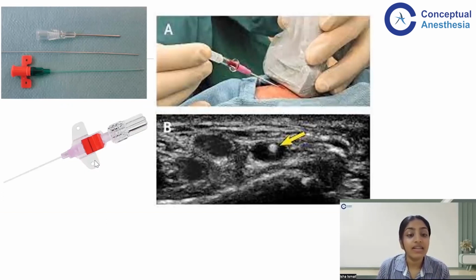So these are the arterial catheters that are available. These are generally utilized in the ICU because we know they're going to be present for a longer time, and they're also difficult insertions, generally low perfusion states. Maybe we're going to put our arterial catheters in the ICU. So we use these Leaderflex radiopaque catheters, which utilize the Seldinger technique. This needle is inserted into the vessel. After the flashback, the guide wire is inserted through it, and then the cannula is railroaded over it.